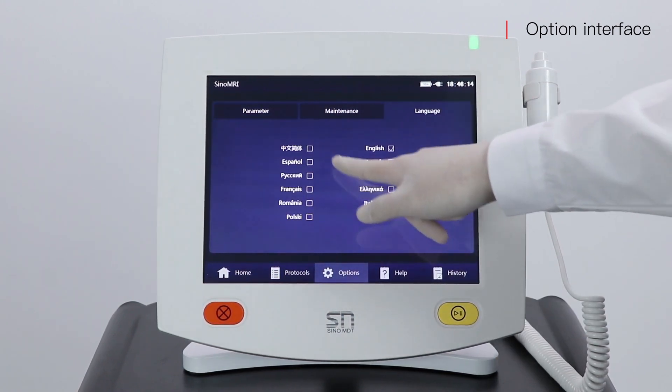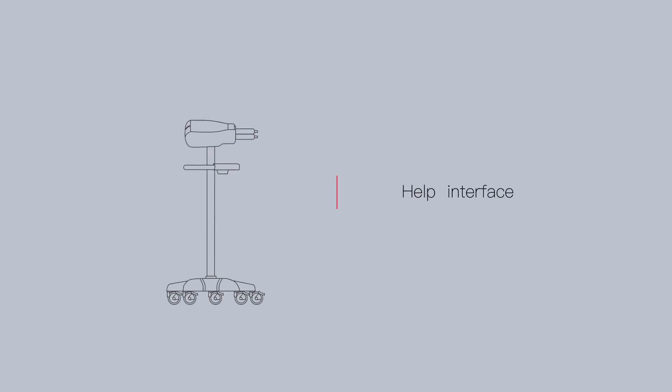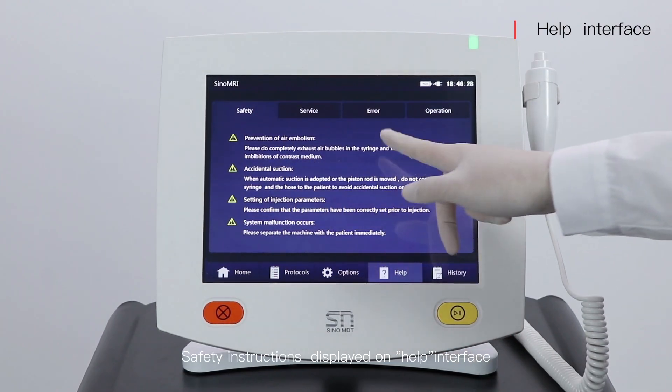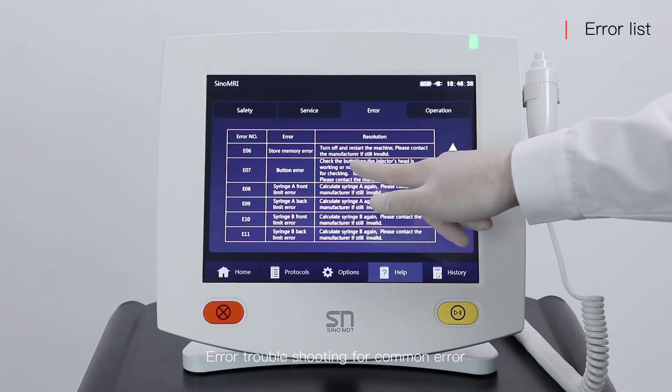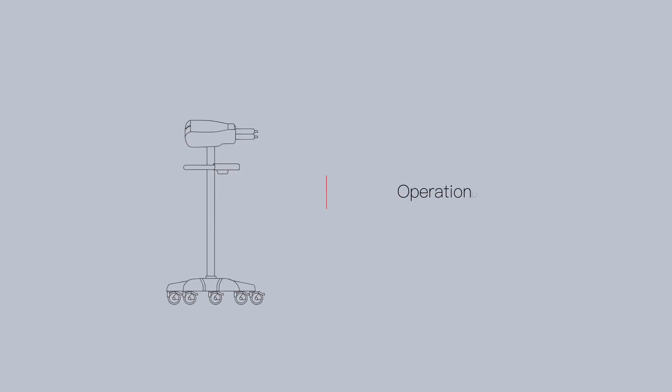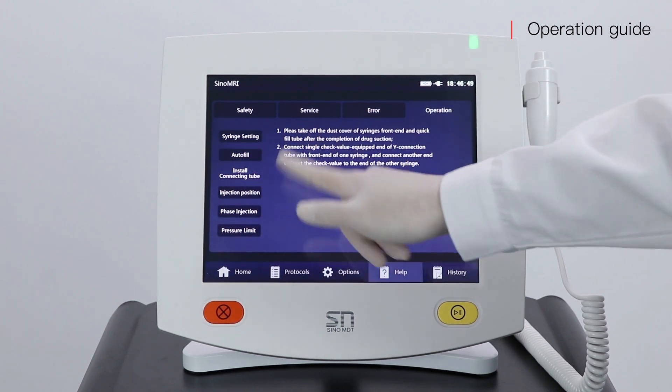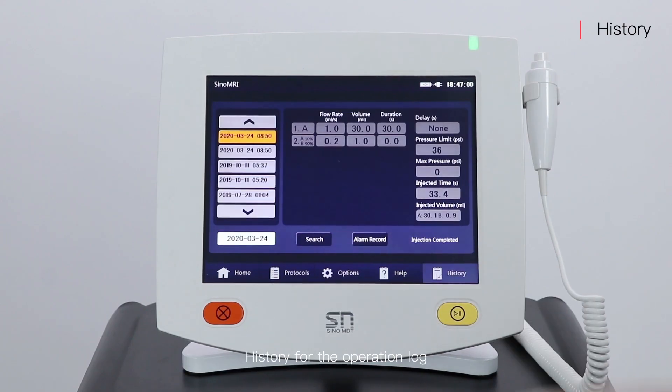Language setting is also available. Safety instructions are displayed on the help interface. Manufacturing information is accessible. Error troubleshooting is available for common errors. The operation guide is provided in case you forget the steps. History shows the operation log.